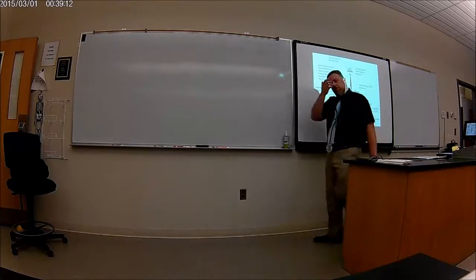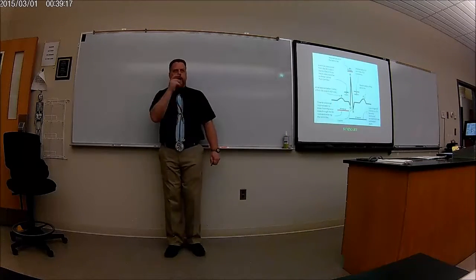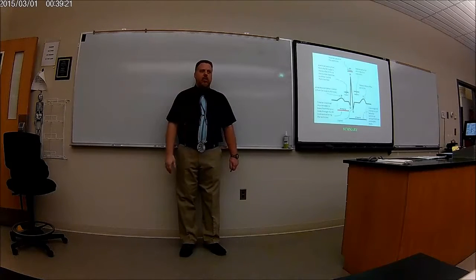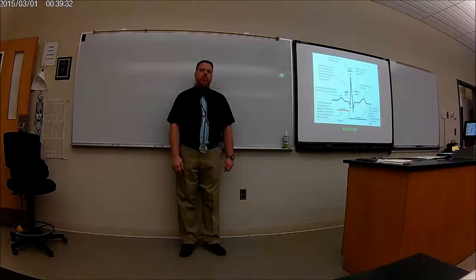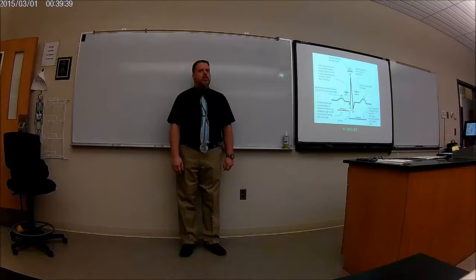Let me ask you this. You get an EKG, okay. You walk 10 blocks. No problem. But for the past couple weeks, I walk 10 blocks, I'm out of breath after 1 block. I get an EKG. It shows some abnormality. It's missing a P wave. What is that telling me?